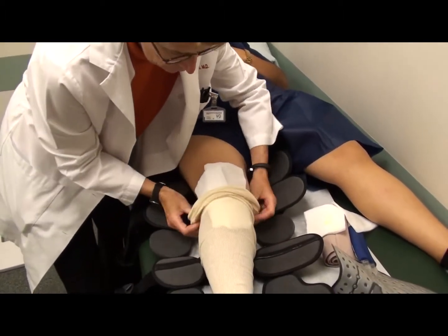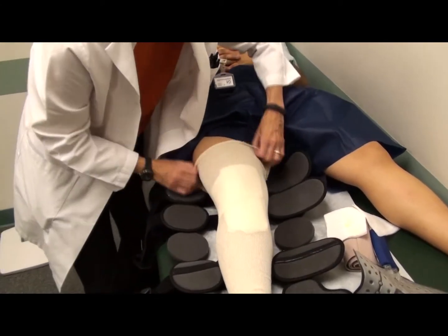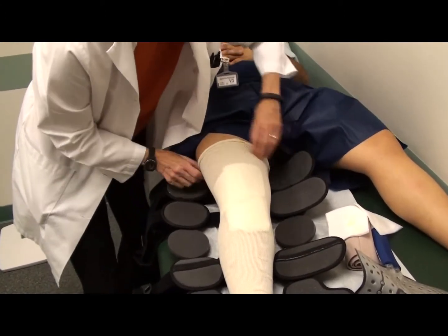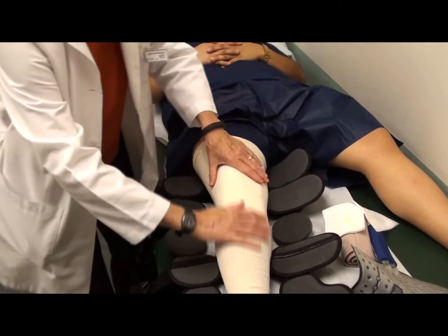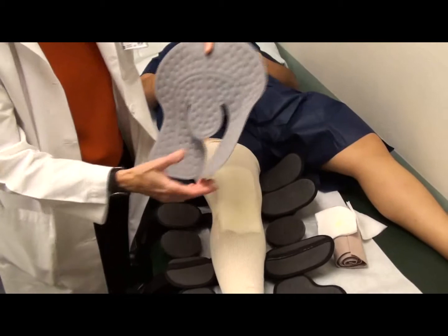Guys, this will be hard for you because you probably never put on stockings before, although in San Francisco many do have that experience. And so then you pull this back up just to cover the wounds. That makes a nice barrier for your cold pad.